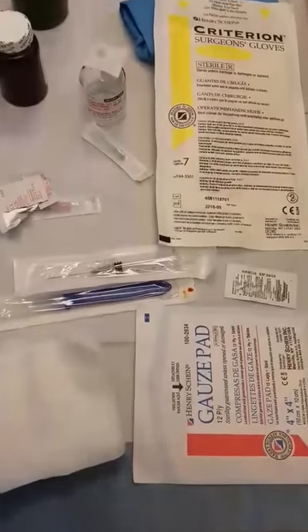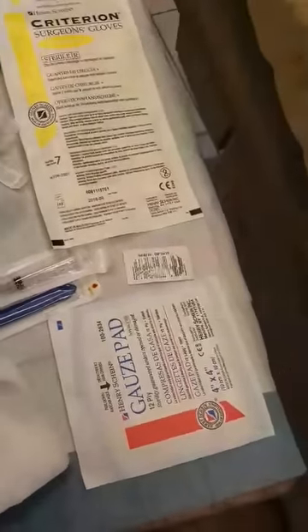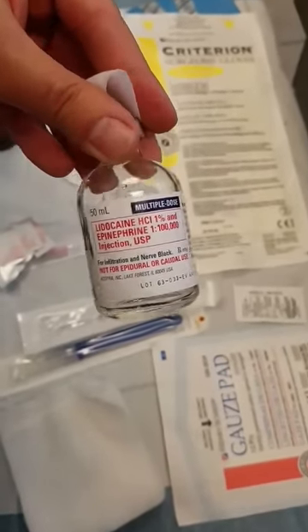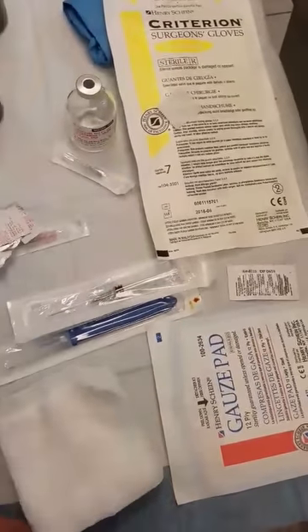First you need to get all your surgical equipment: gauze, scalpels, lidocaine — make sure you use it with epi so that way you get decreased blood flow to the area. And then surgical gear, betadine and gauze.